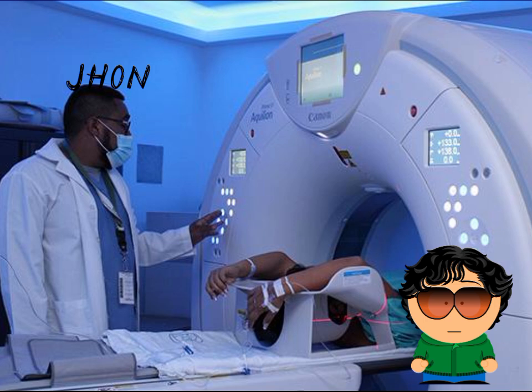Types of tomography. Computed tomography (CT) uses X-rays and computer systems to obtain detailed axial sections or images of the body. It is one of the most common types. Positron emission tomography, PET, a functional technique that detects metabolic activity in tissues, is used in oncology and neurology.